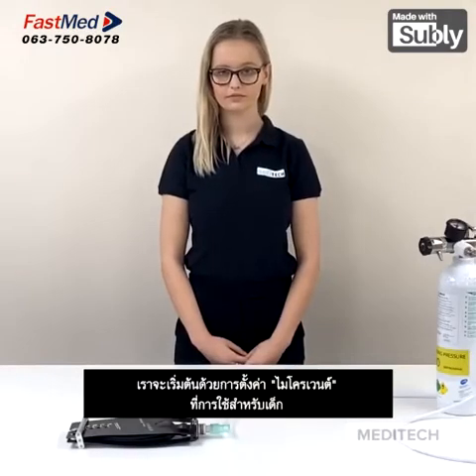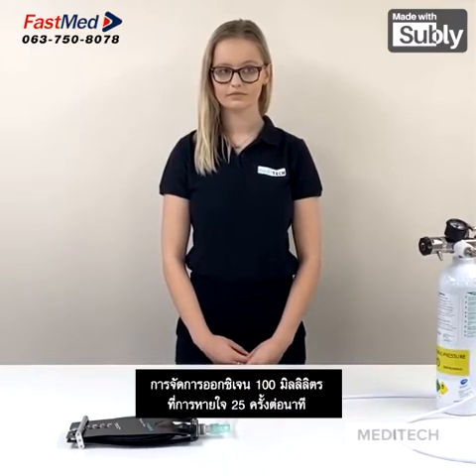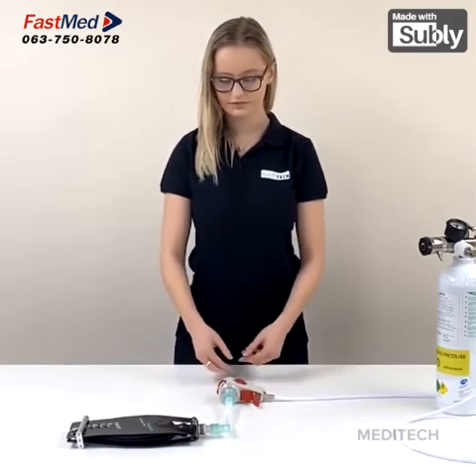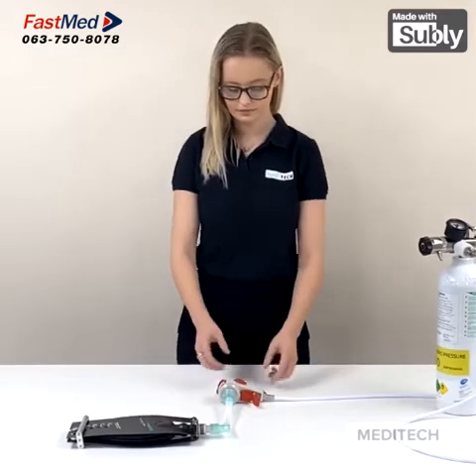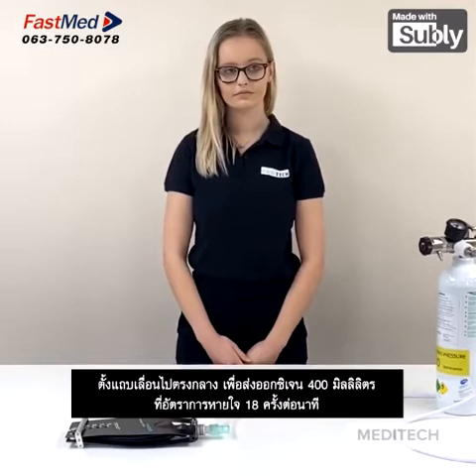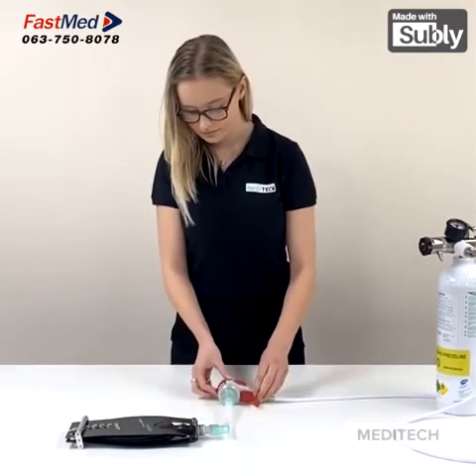We will now connect the device to the test lung to show you the varied tidal volume and breath rates. We will start off by setting the Microvent at the child end of the range, administering 150 millilitres of oxygen at 25 breaths per minute. Now we will set the slider in the middle of the range: 400 millilitres of oxygen at 18 breaths per minute.